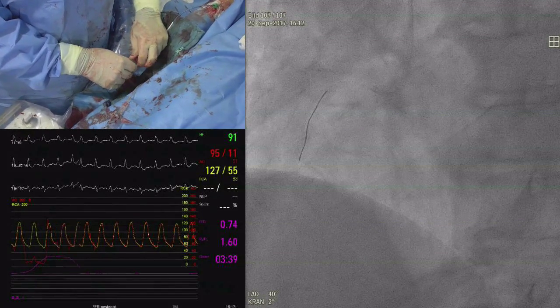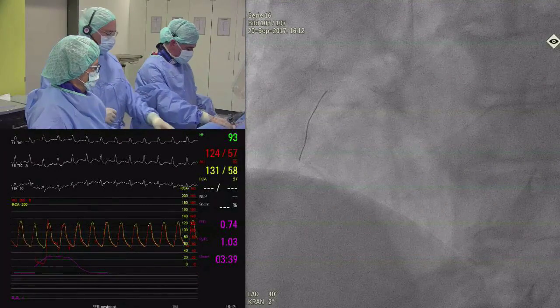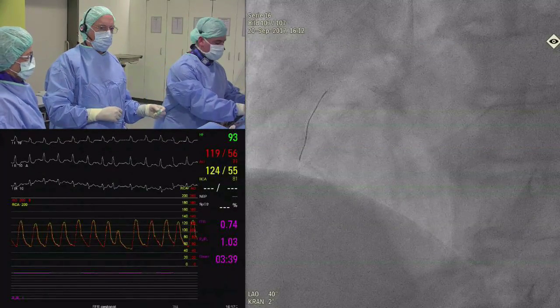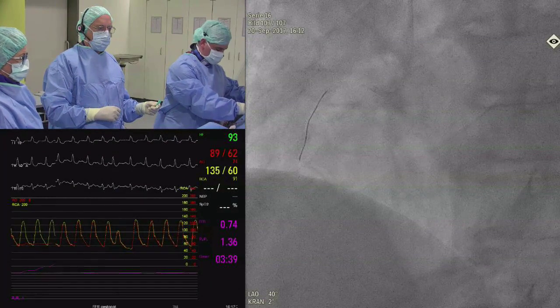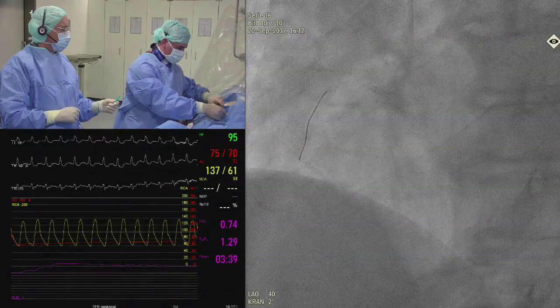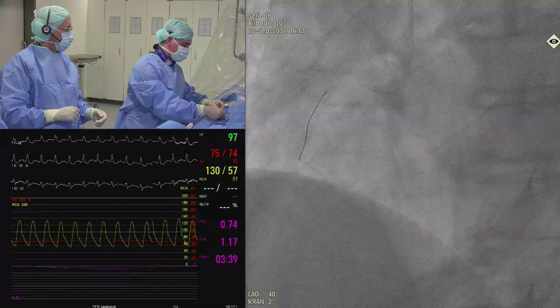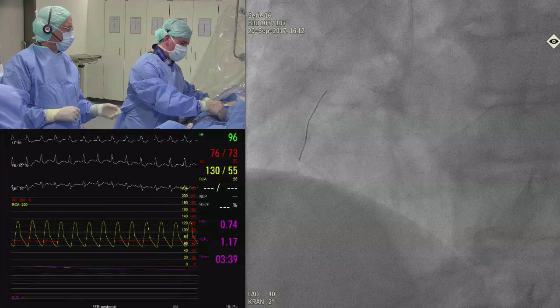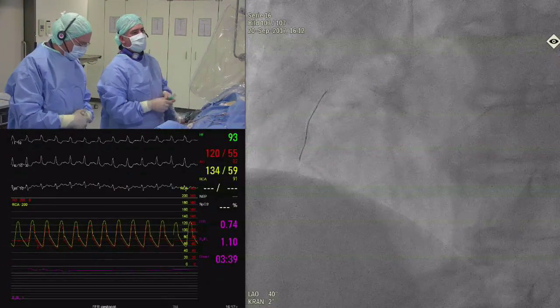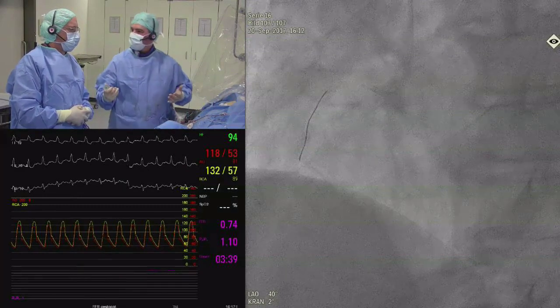The other thing I have a question about is, in terms of practical interventional strategy, you have that angulated lesion in the mid vessel, but then there's a distal intermediate lesion. So you would stent the more proximal lesion, and then see what's the residual FFR after. But that goes against conventional wisdom, because you always treat from distal to proximal, and there's always a chance that you get stuck in the more proximal stent, complicating the procedure, or you just treat the whole thing with a long stent and forget about the serial lesions. Well, actually, to be honest, I would rather be convinced that the problem is distal to this S-shaped part.